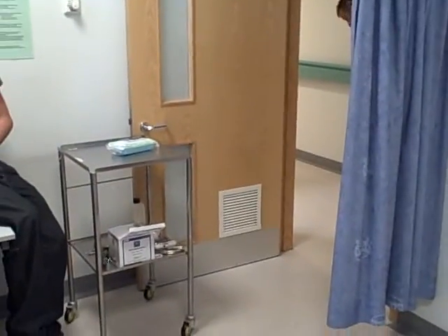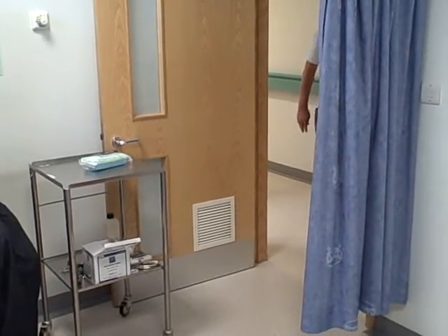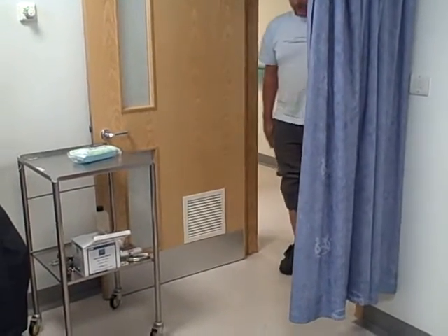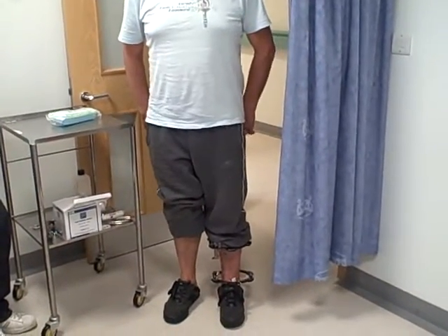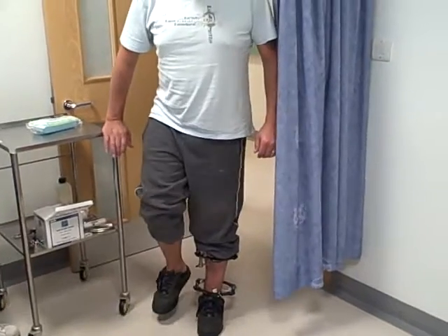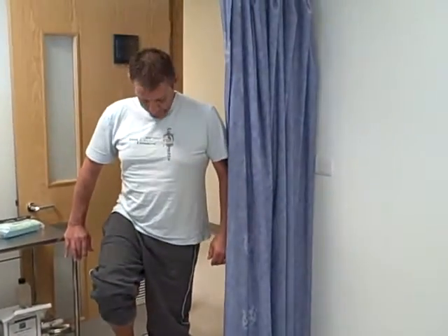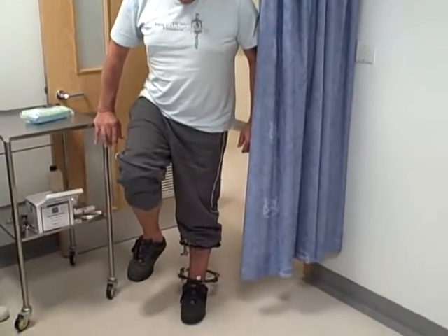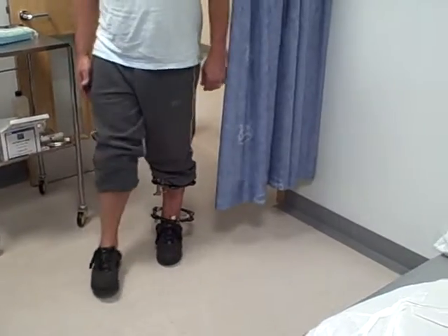How's that feeling? Fine, can't feel anything. Let's come back again. It's feeling OK? Fine. OK, stay there for a second, John. Just stand on one leg again if you can — just balance if you can. And does that feel OK? Yeah. Jolly good. OK, we can go ahead now and take the rings off. Excellent.